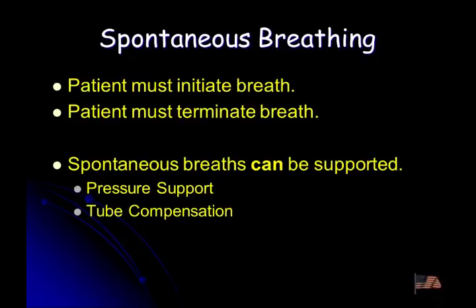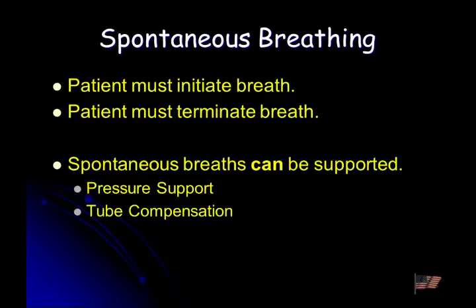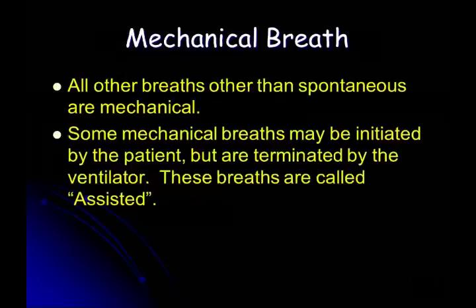There's also something we'll talk about called tube compensation that is a little bit of a modification of this concept of pressure support. And we'll get there eventually. Mechanical breaths are all other ones. Anytime the patient doesn't start and end the breath, we're going to classify that as a mandatory or mechanical breath.